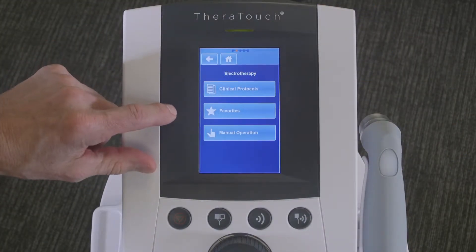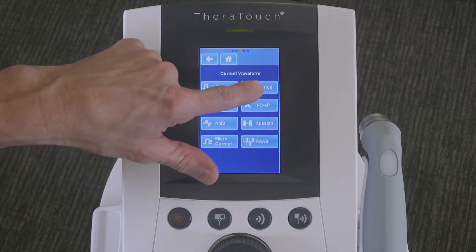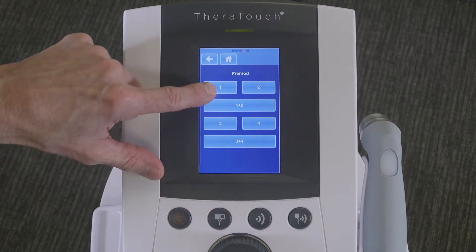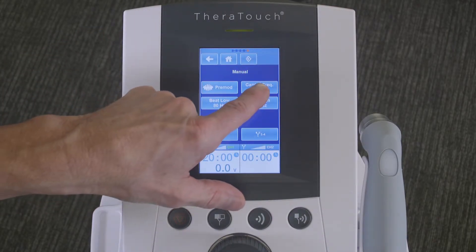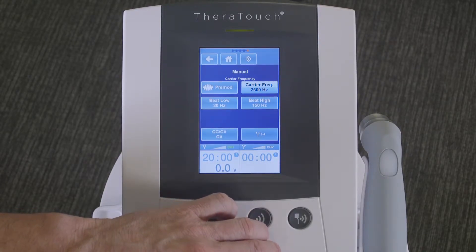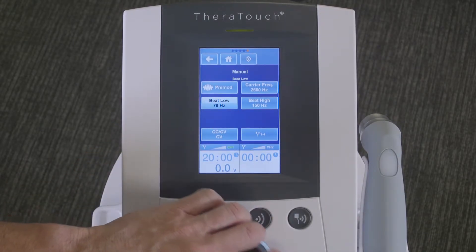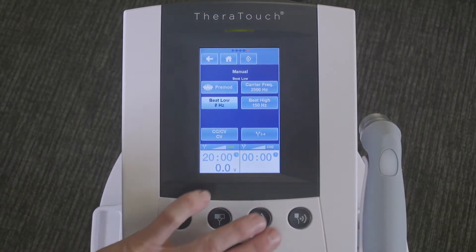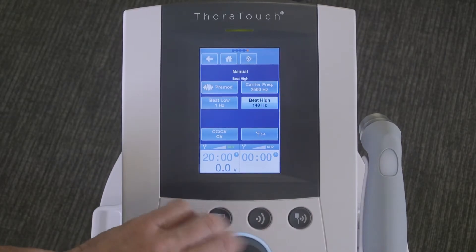Select electrotherapy. Go to manual operation. Select premod. Select the appropriate channel you're using — in this case, channel one. We're going to change the carrier frequency to 2,500 hertz, with a beat low frequency of one and a beat high frequency of ten.